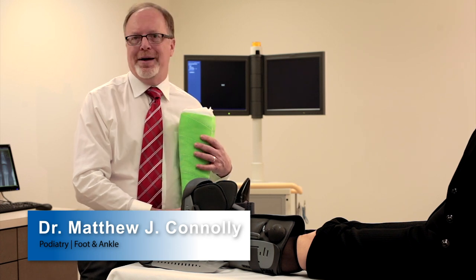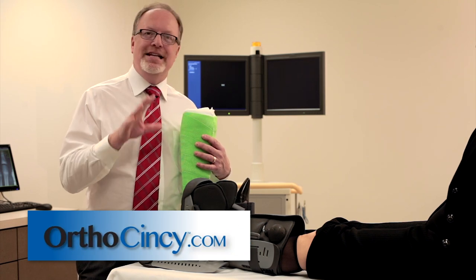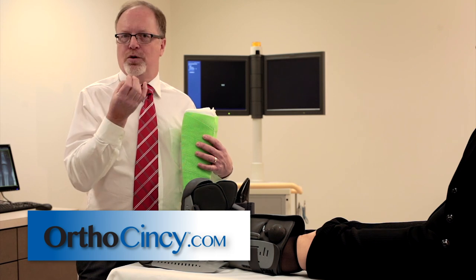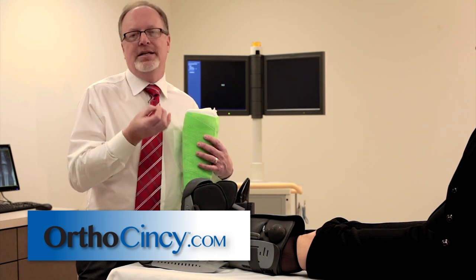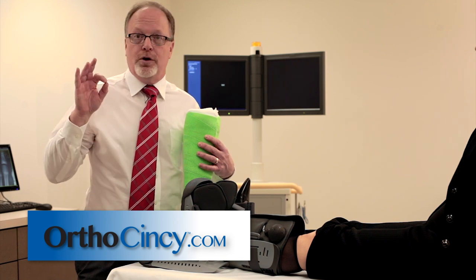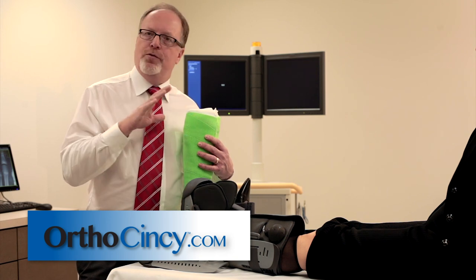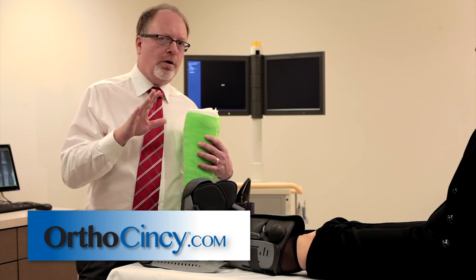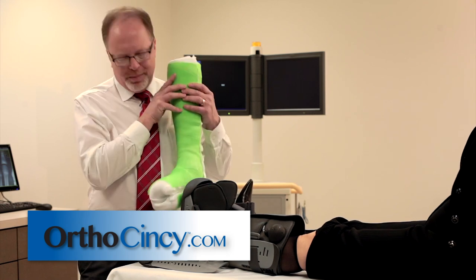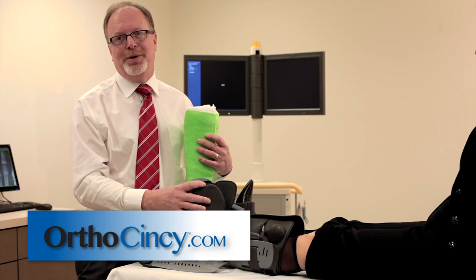What we're going to talk about today assumes that you've been diagnosed with a fracture or a sprain that needs to be held still. There are some fractures and sprains that could be held still with minimal bracing, sometimes soft bracing. And sometimes things are so bad that you have to go to a screw or pin fixation and a lot more internal approach. But if we can externally hold your trauma still, we can use one of these two devices — one being a cast and the other being a boot — and we're going to discuss how to pick between the two.